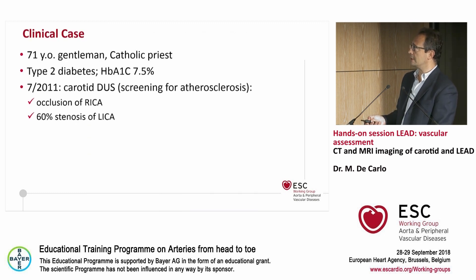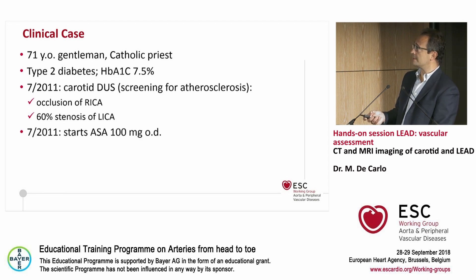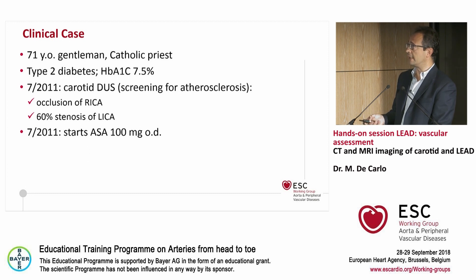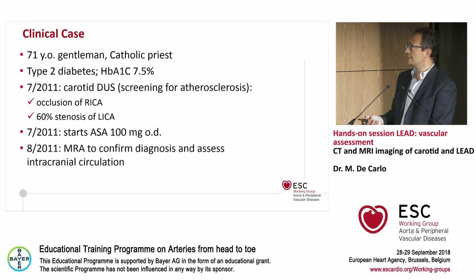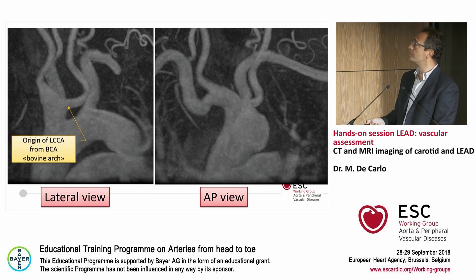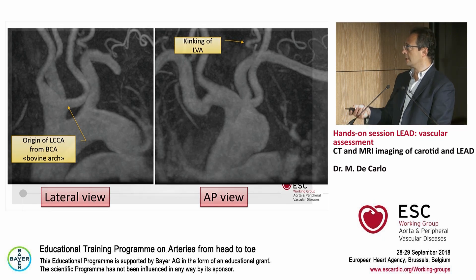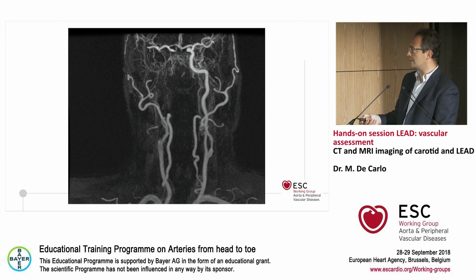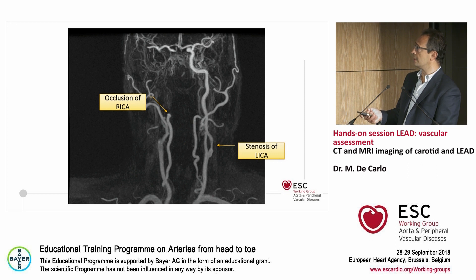Here is a clinical case. This patient had poorly controlled diabetes, and while undergoing screening for atherosclerosis, duplex ultrasound of the carotids found an occluded right internal carotid and a 60% stenosis of the left internal carotid. He underwent MRA to confirm the diagnosis and assess the intracranial circulation. The MRA views are very nice — you can see he has a bovine arch, assess the vertebral arteries, and clearly see the stenosis of the left internal carotid artery and the occlusion of the right internal carotid artery.